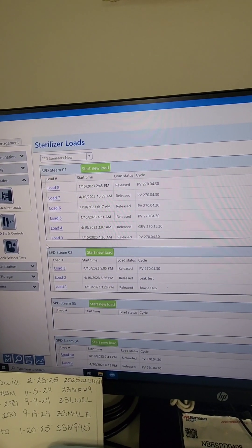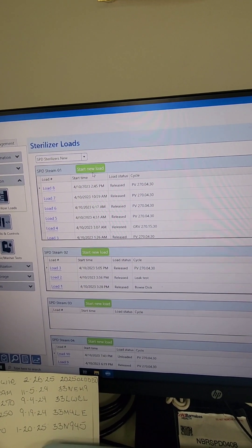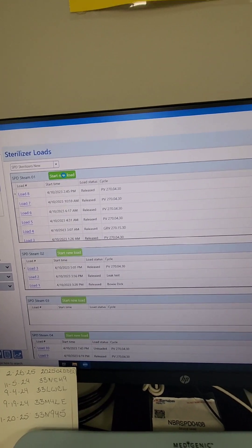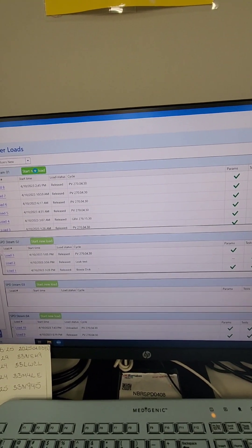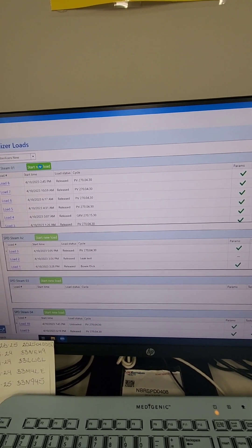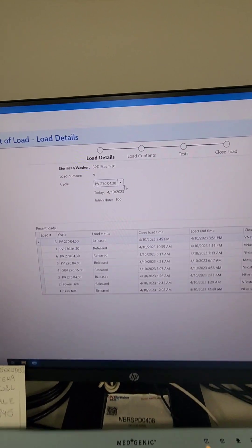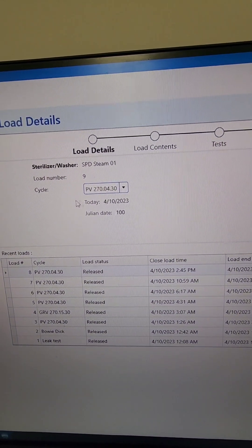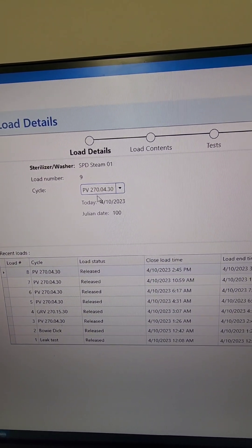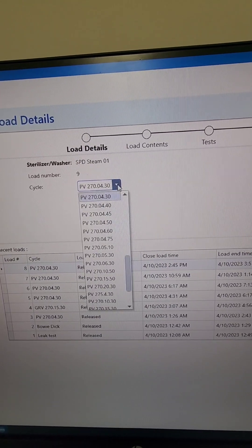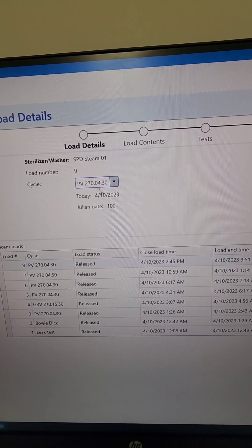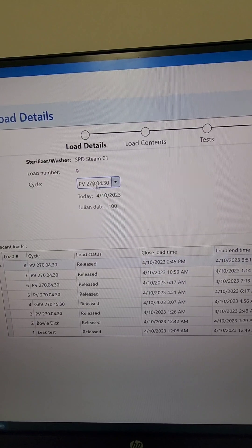As you can see on my tracking system, all my sterilizer names are sectioned off and every load that's done is highlighted there. I'm going to go ahead and start a new load. The parameter that I'm running is a 270, 430, so you want to make sure you're on the right parameter.